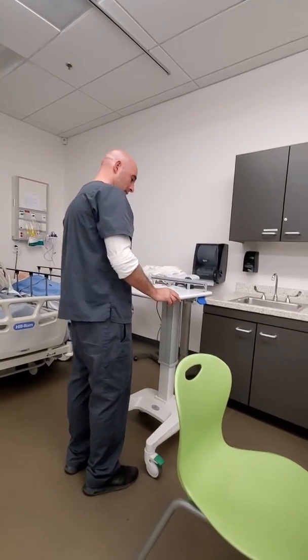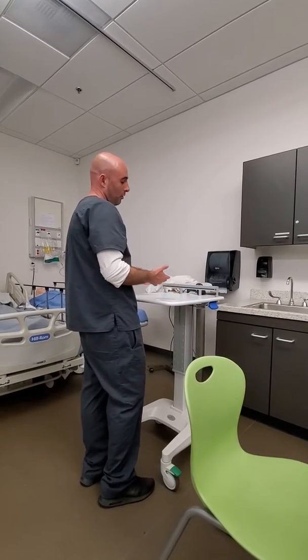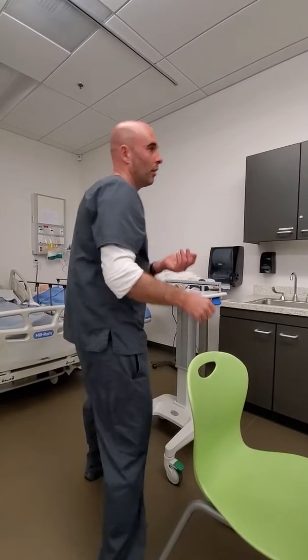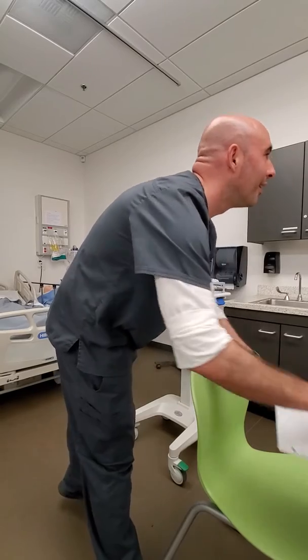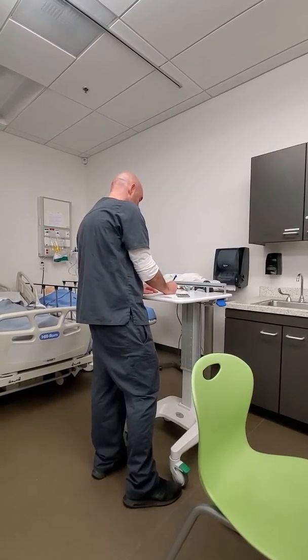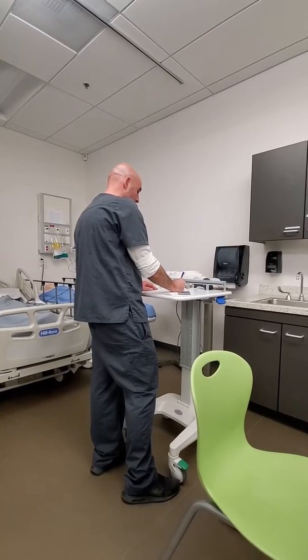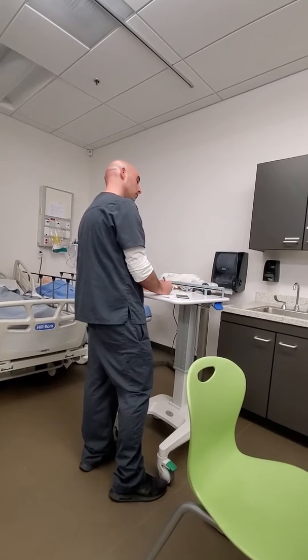And what is this for? That's your IV piggyback tag, that's your date and time. And on the computer, the order will be what you said: 1 gram in 100 milliliters to infuse over that 45 minutes. Okay, we'll use that. And the doctor's orders typically don't have the time to infuse, so we'll give it to you.